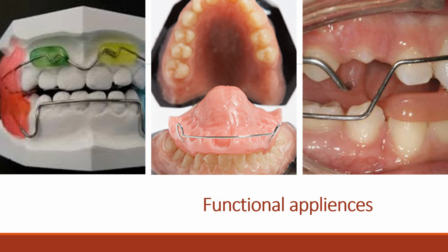Functional appliances are used in the growing patient, often in conjunction with extraoral force to help correct both sagittal and vertical skeletal discrepancies, usually prior to the use of fixed appliances.